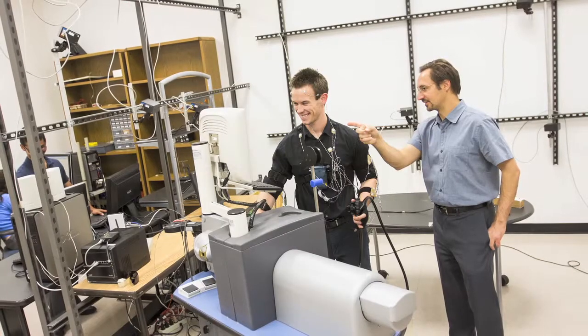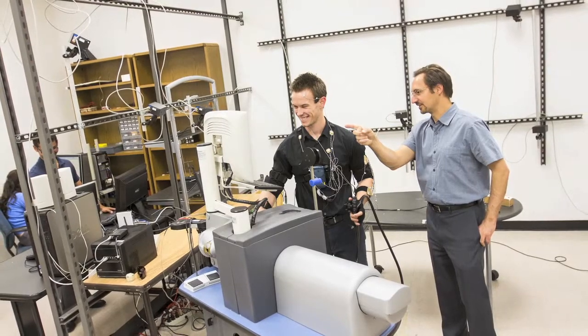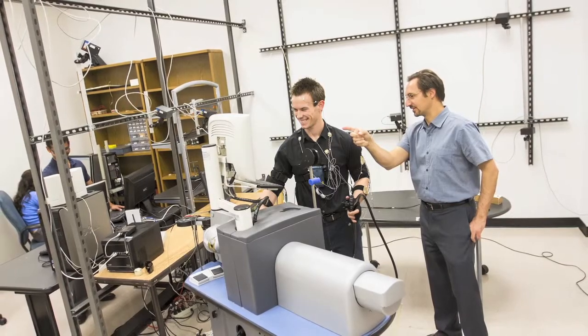So basically what we do at the beginning is a calibration procedure, whose ranges are subject dependent. Each subject has different ranges of motion, so for each subject, what we measure is the extreme range of motion. For example, with the sensors on the wrist, we would ask them to assume an extreme supination or pronation. Based on that, you characterize the midpoint of the range of motion, and then we define for that particular subject how often you encounter those particular areas. And the same for flexion extension and the same for adduction abduction.